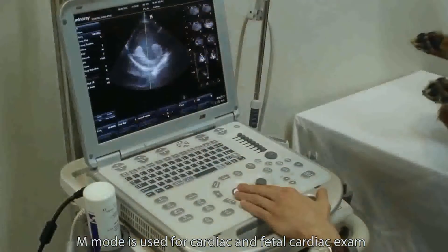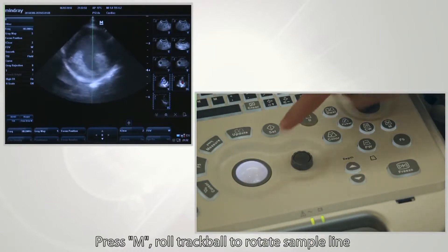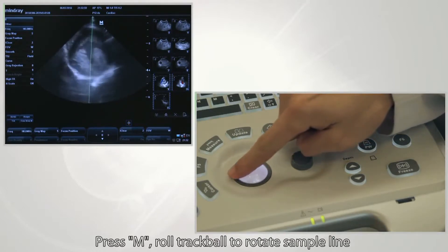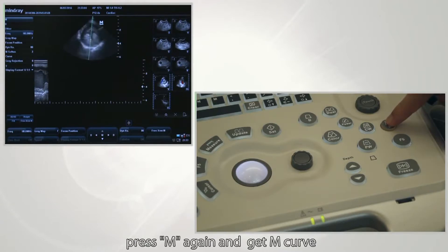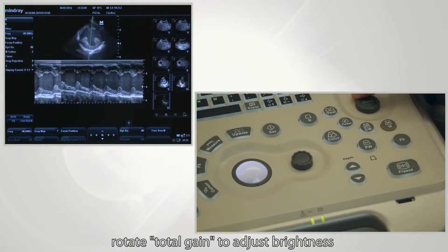M mode is used for cardiac and fetal cardiac exams. Press the M button and roll the trackball to rotate the sample line. Press M again to get the M curve. Rotate total gain to adjust brightness.